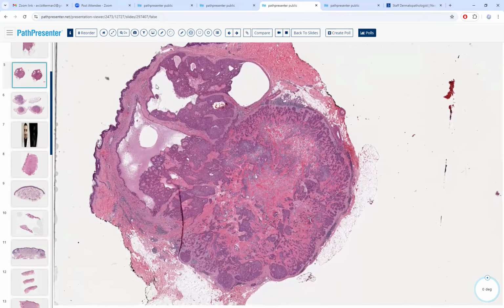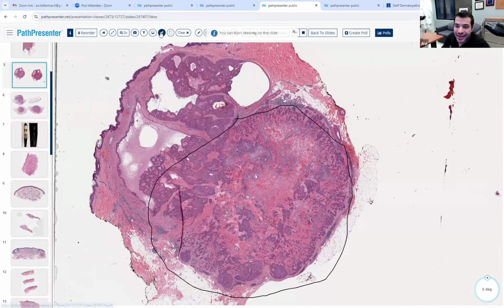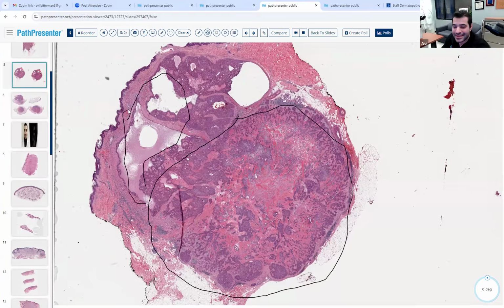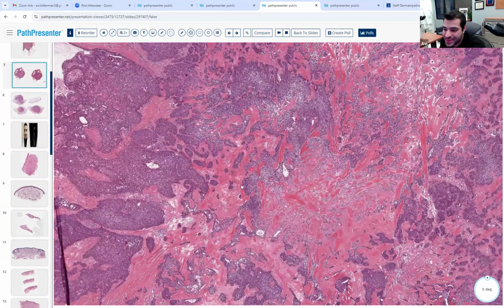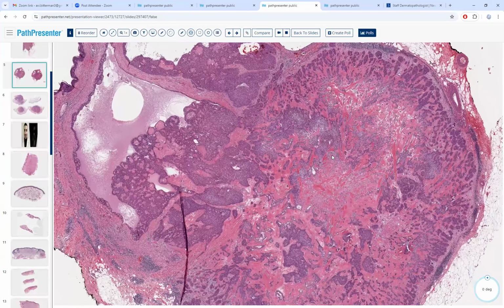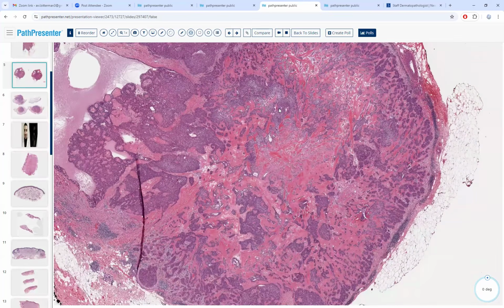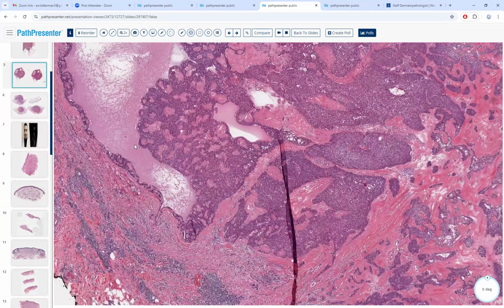It looks more nodular. It is nodular than the other one. So it has a nodular component. It appears to be like a hidradenoma that has multiple components, like a cystic versus. Yeah, it has a cystic component and it also has a nodular component. And you said hidradenoma. So what tips you off to hidradenoma? I remember there are 3 different cell lineages, like poroid, squamoid versus clear cells. I think there are definitely some epithelial, squamous type. I'm not sure if I can see some clear cell.